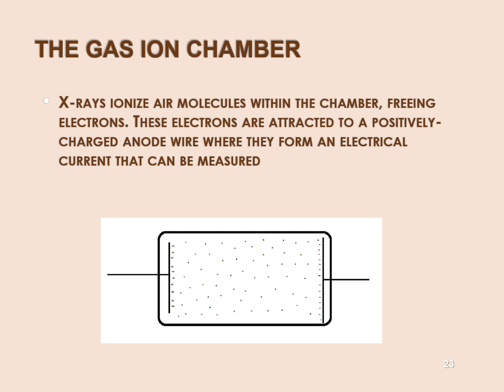So it kind of acts like a radiation sensitive switch. And when it absorbs enough radiation, it closes the circuit, activates the switch, and then you shut off the electricity to the X-ray tube by activating this switch, right? So it's a kill switch for the X-ray circuit, okay?